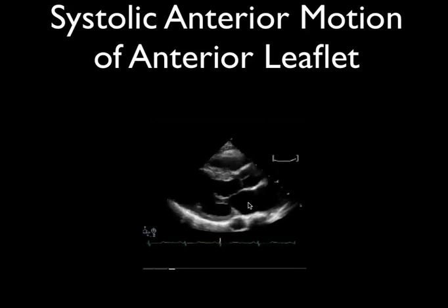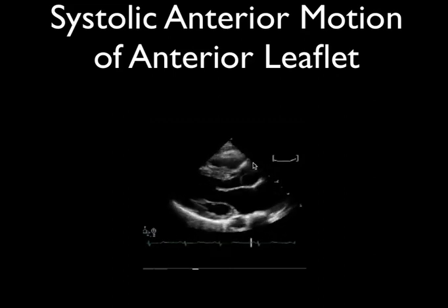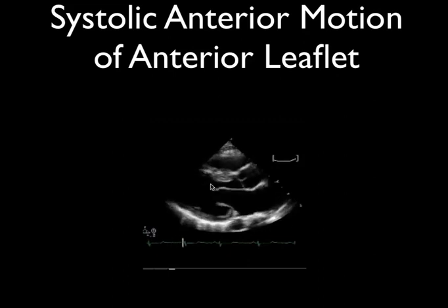So remember, this is the left atrium, this is the left ventricle, this is the aortic outflow tract. And look what happens. This is a very thickened septum. These are little 1 centimeter hash marks here, so this is approaching 2 centimeters.